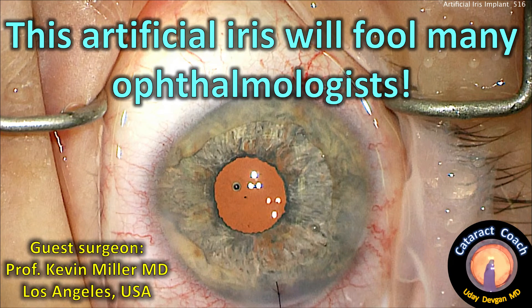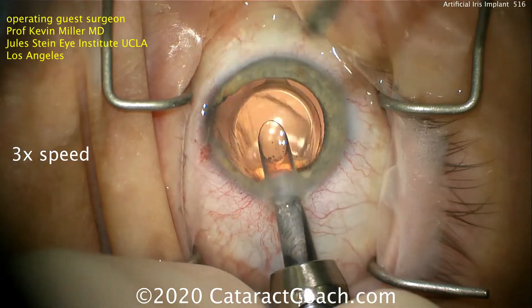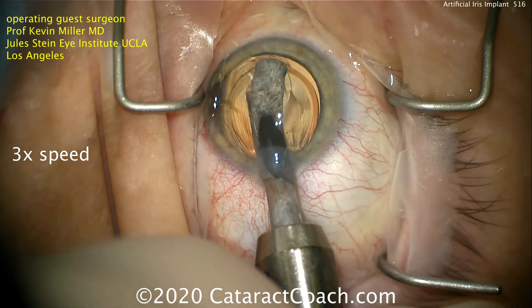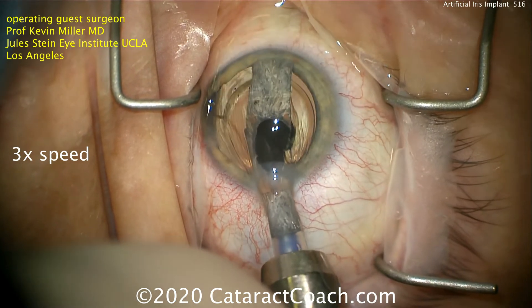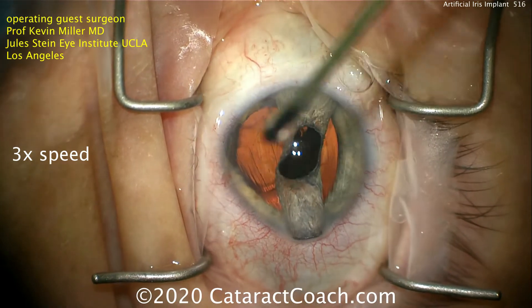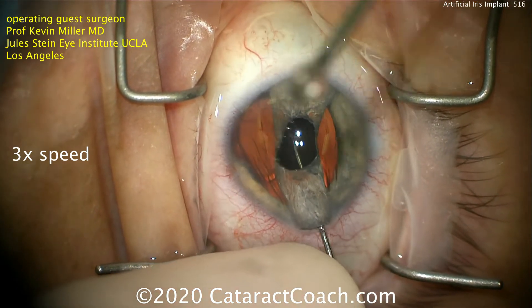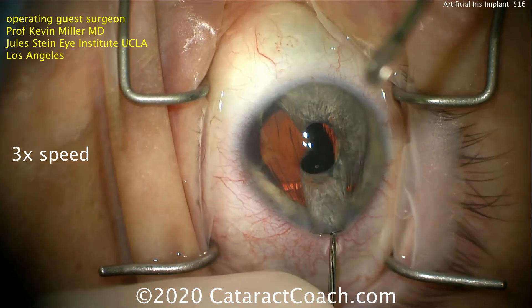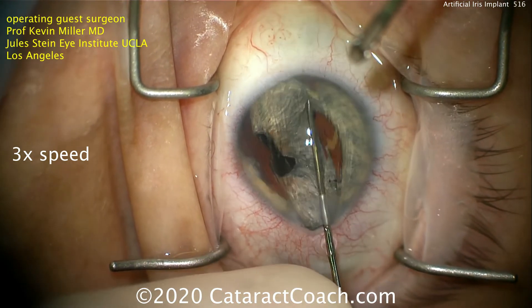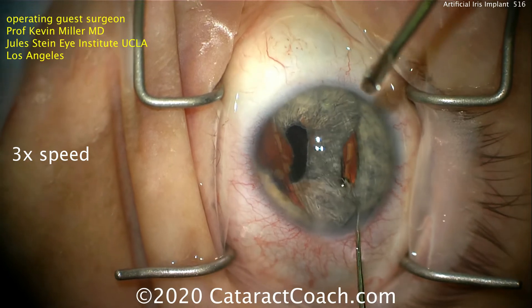CataractCoach.com, showing you an artificial iris. Guest surgeon Professor Kevin Miller from Los Angeles. This is a very special video. Dr. Miller has a lot of experience in doing iris reconstruction and using these artificial iris implants of various designs. He's been doing this for more than 20 years. Dr. Miller was one of my very important professors and mentors in my training, so it's an honor to have a video from him here on CataractCoach.com.